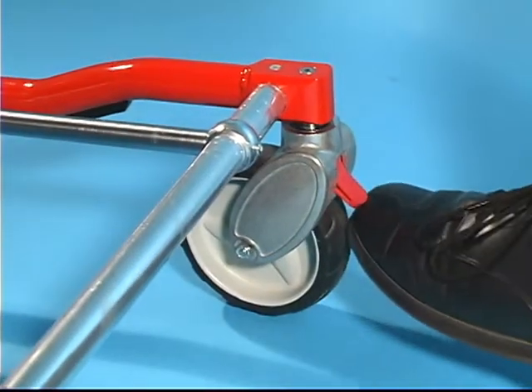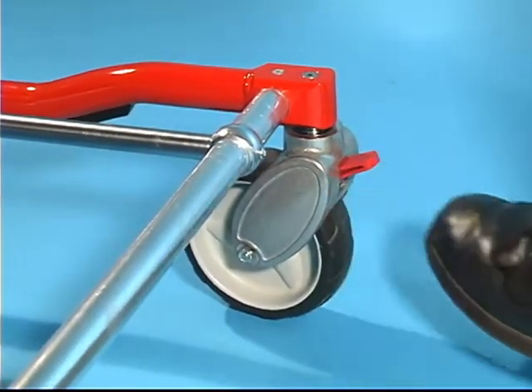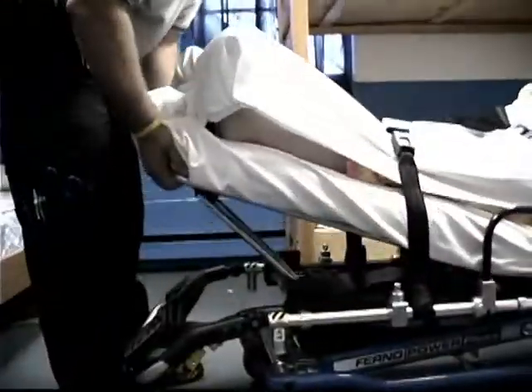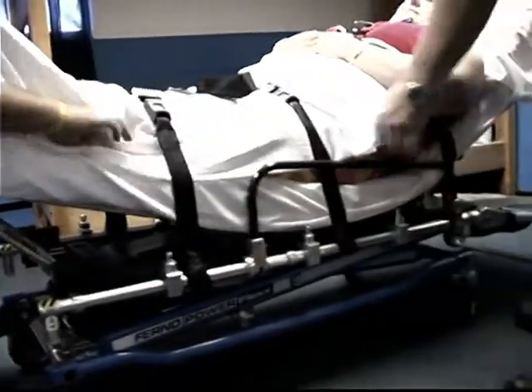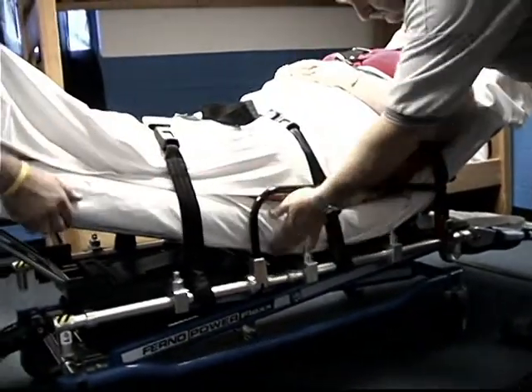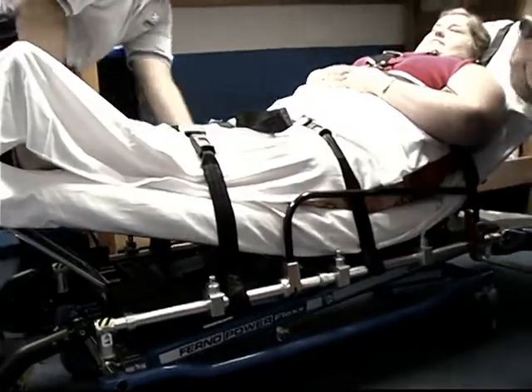Disengage wheel locks by lifting the lock lever up with your toe. Raise the side arms and adjust the back rest and shock frame as needed. Before moving the cot or changing its position, make sure sheets and other articles will not interfere with the cot operation.